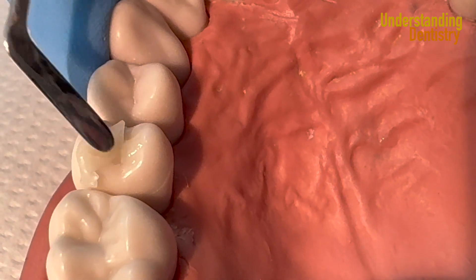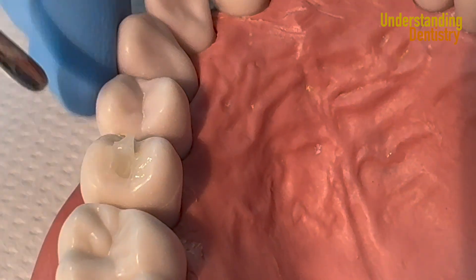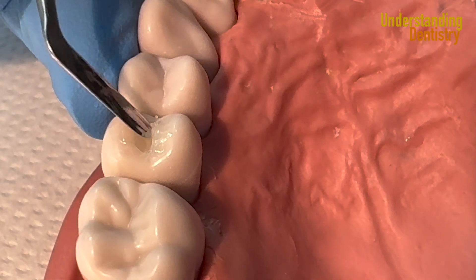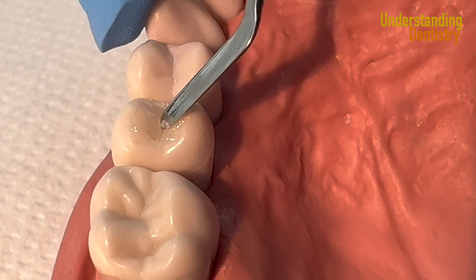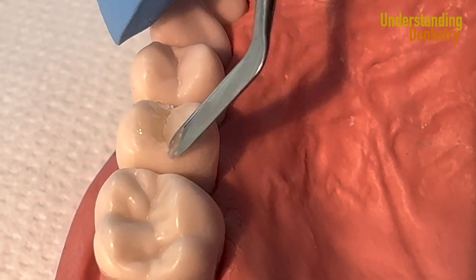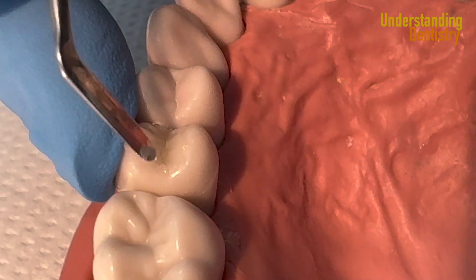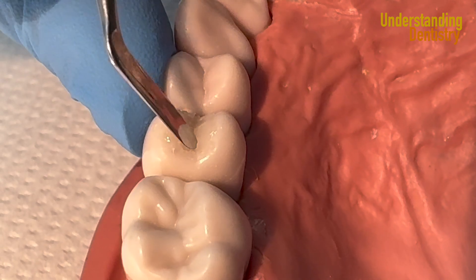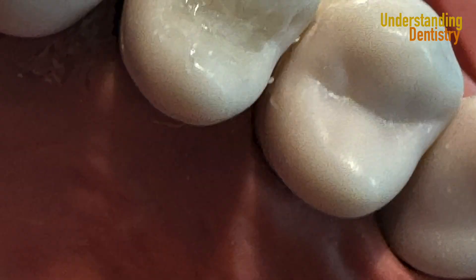If needed, you can add more increments, still removing the excess while creating the anatomy. Just to show you guys another increment — creating the final anatomy and the sulcus with the tip of the plastic instrument at the same time. That's why you should have a very nice plastic instrument.